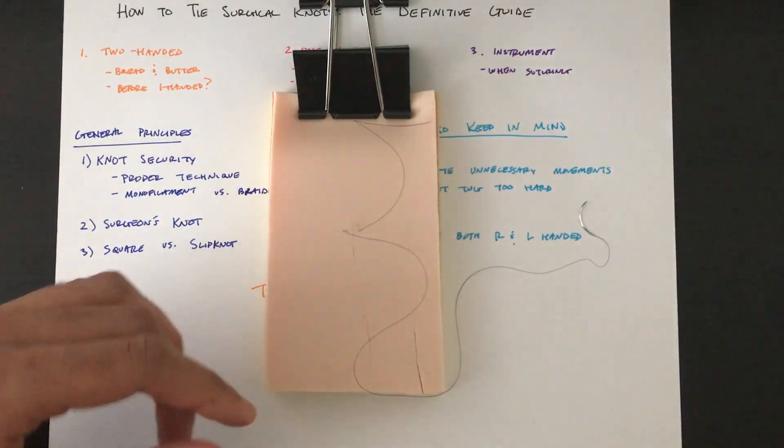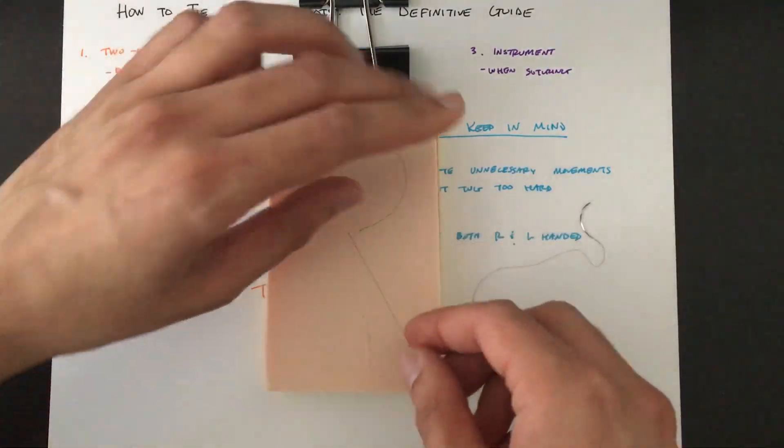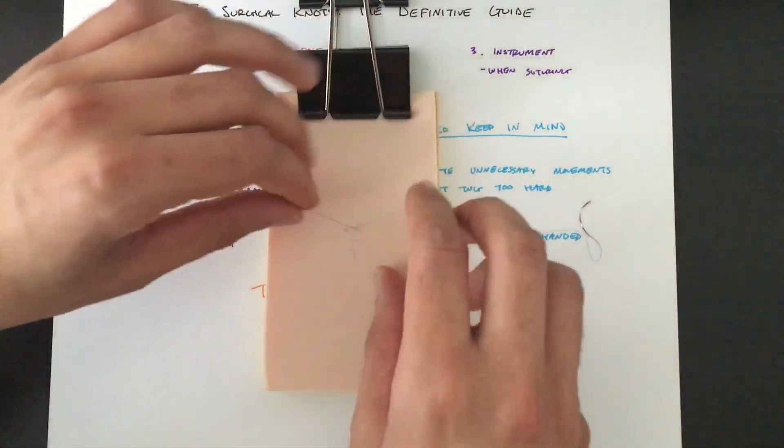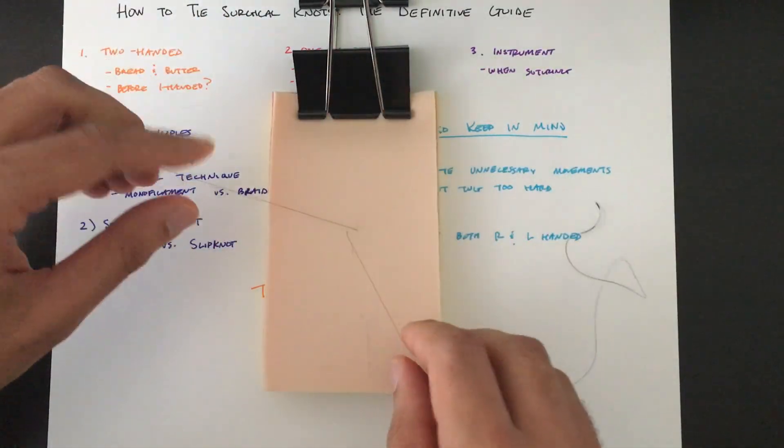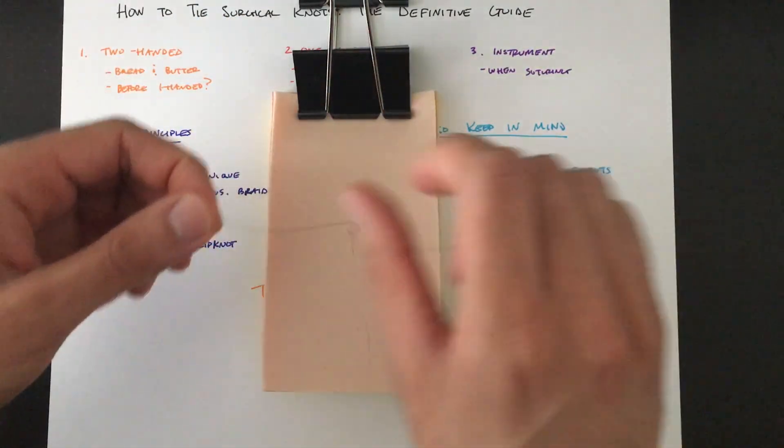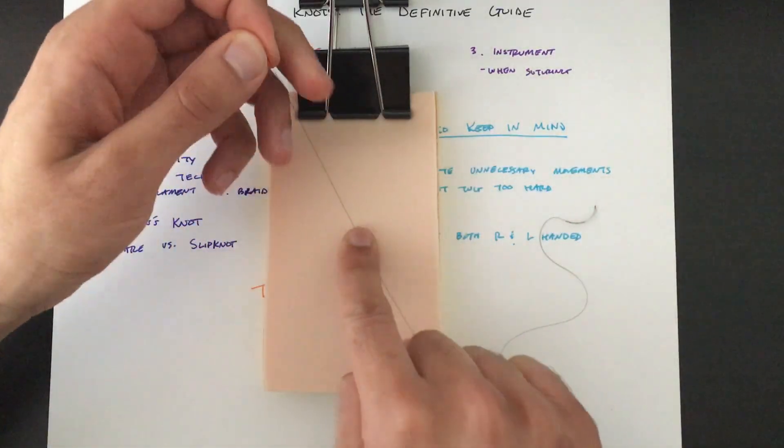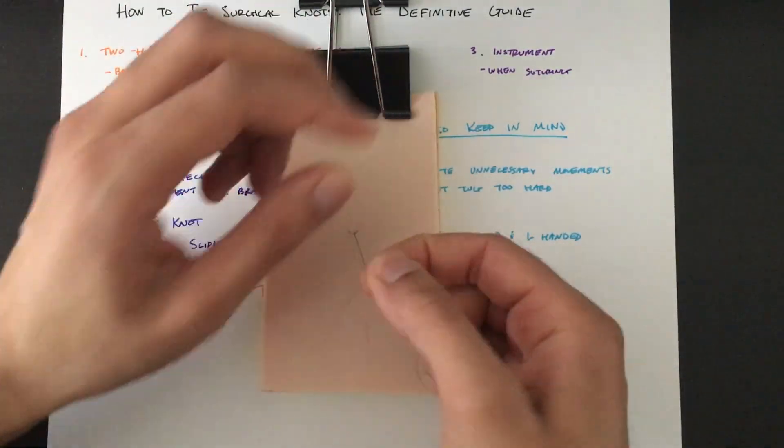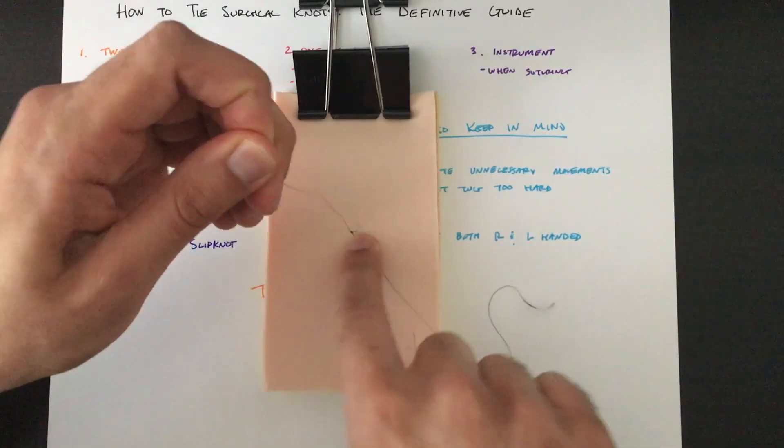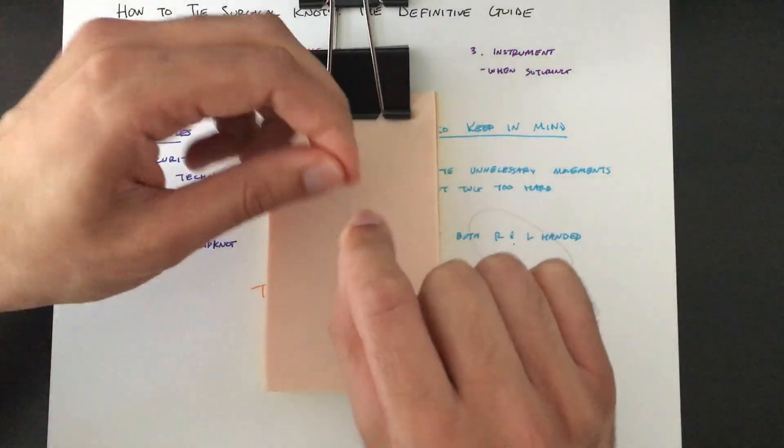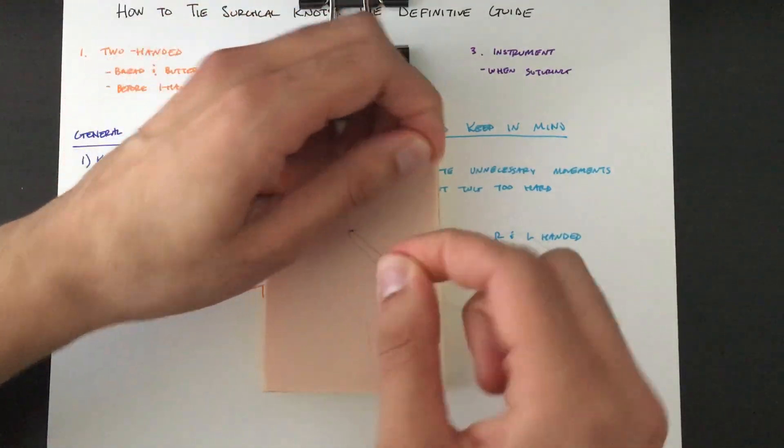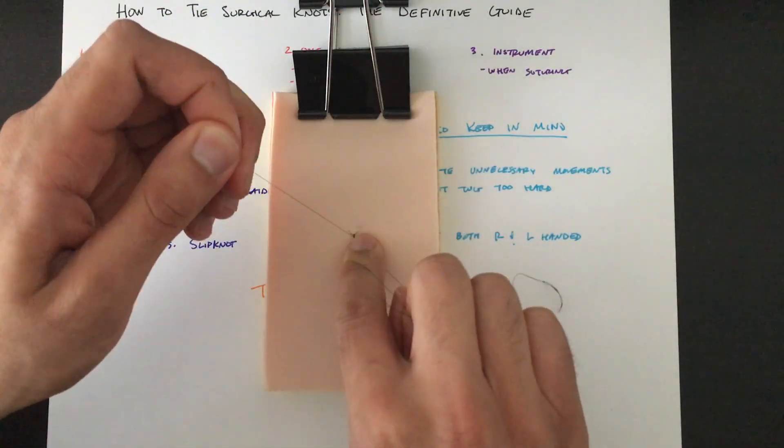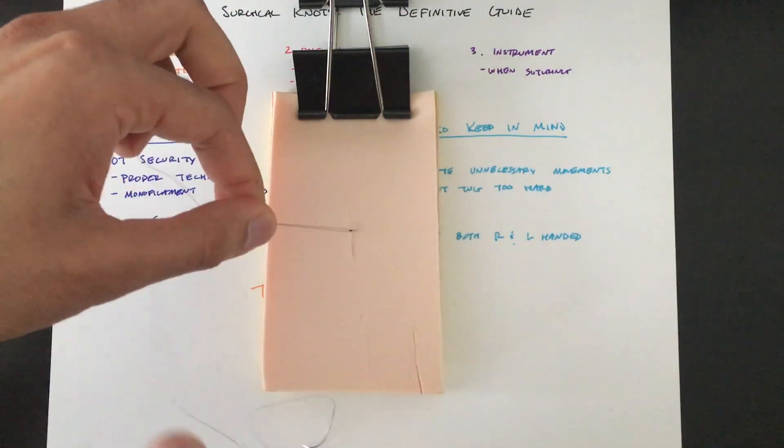Alright guys, so this is the suturing kit that I use to practice. Let me show you what it would actually look like as if you were suturing on skin. So let's do a two-handed knot. So I'm going to criss-cross like so. And there you go.